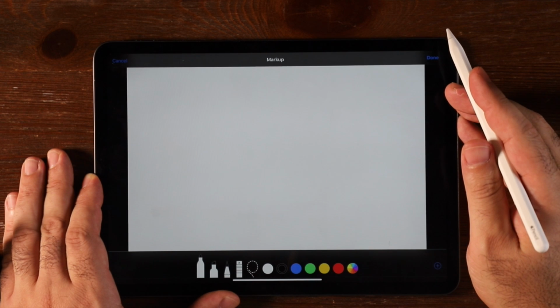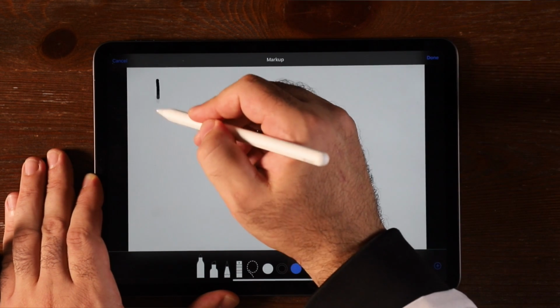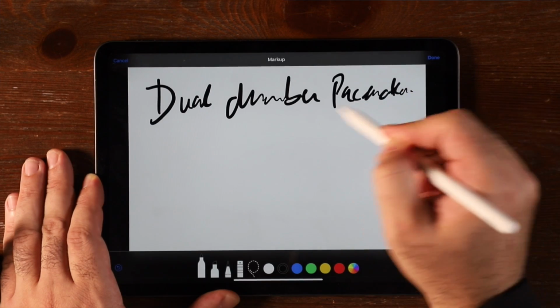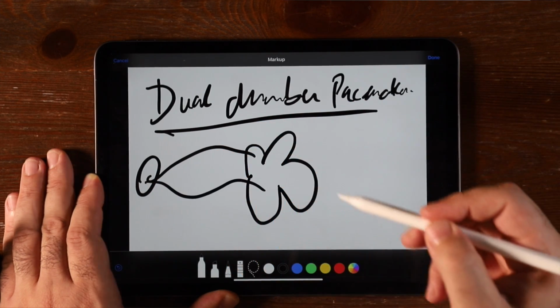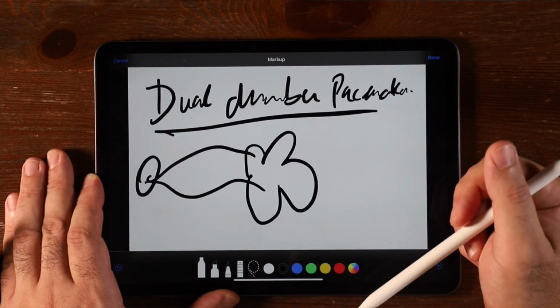The next definition that I want you to know is that there is a dual chamber pacemaker. So what does that mean? It means that when you've got the heart like that, and this is the pacemaker, you've got 2 leads, one coming to the right atrium, and one coming to the right ventricle.